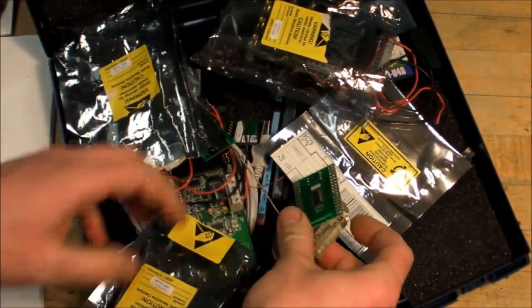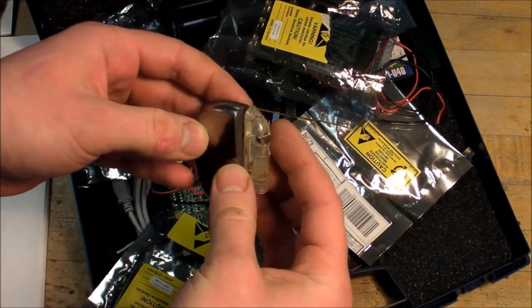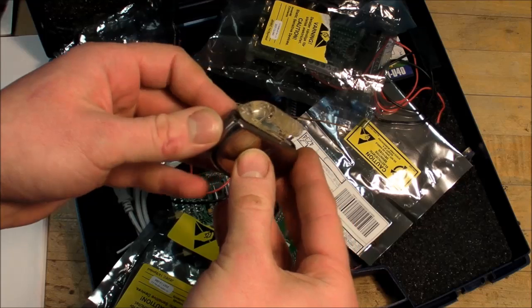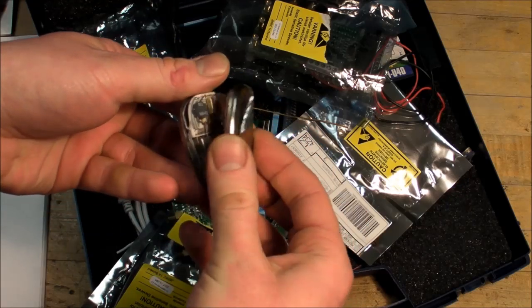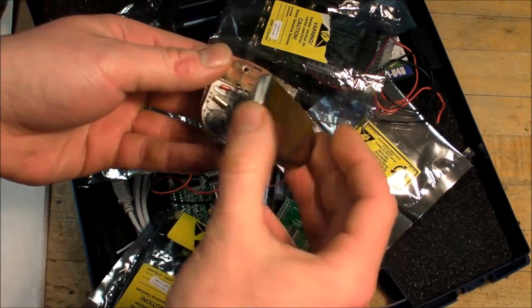But the thing, of course, of interest right now is this thing. Somebody donated it to them. They've already taken a Dremel to it to open it up, so that'll save me the trouble.